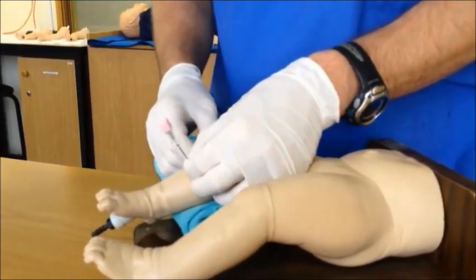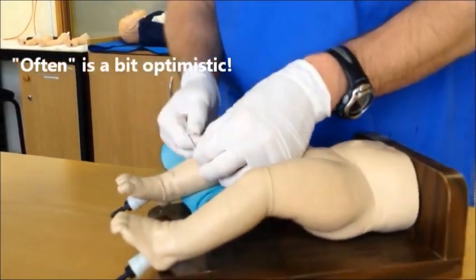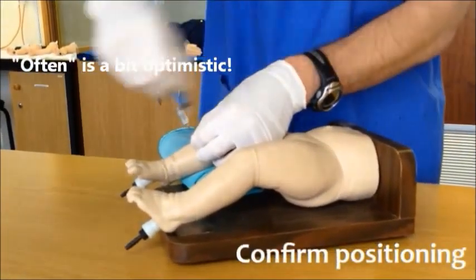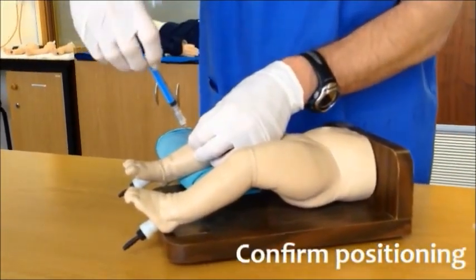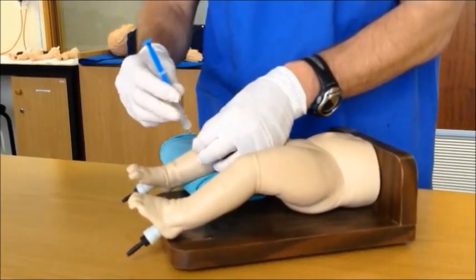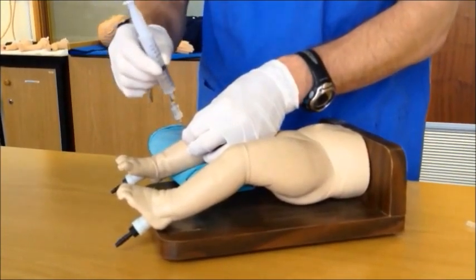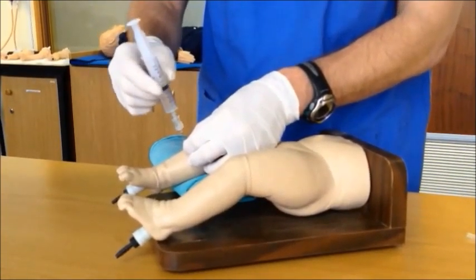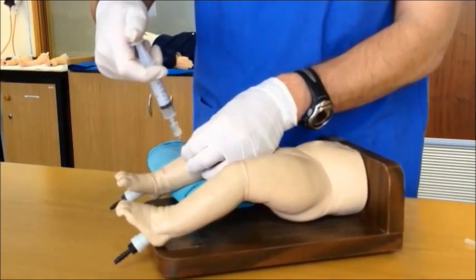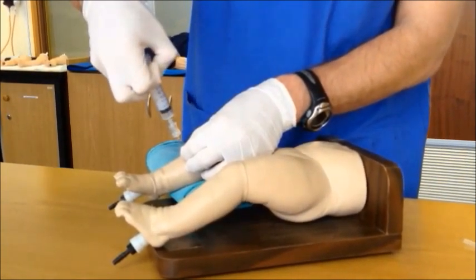Firmly grasp the needle, secure it to the skin and remove the stylet. One would often have spontaneous flush of blood into the needle at this time. If not, attach a syringe to the end and aspirate to see if you can see any blood coming back. Another way to confirm position is to take a pre-filled saline syringe and attach it to the back of the needle and infuse the fluid into the marrow space. Please note that there should be more resistance felt than with standard vascular access, but that excessive force should not be necessary.